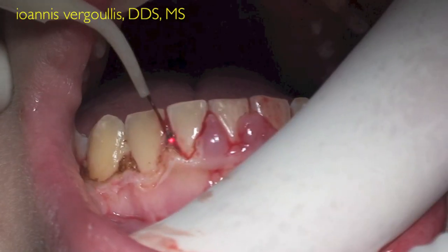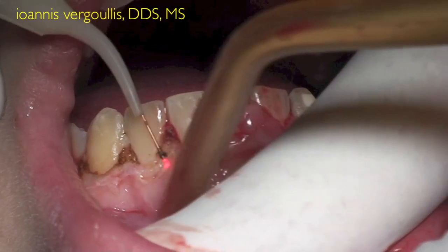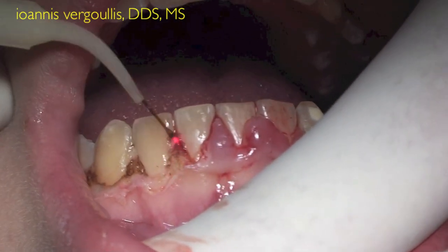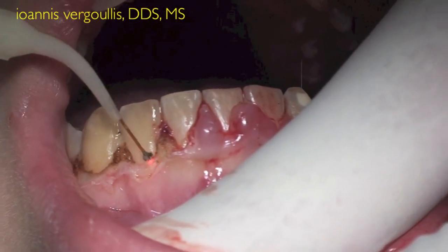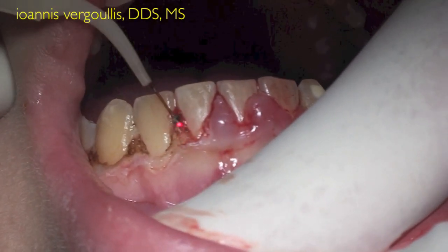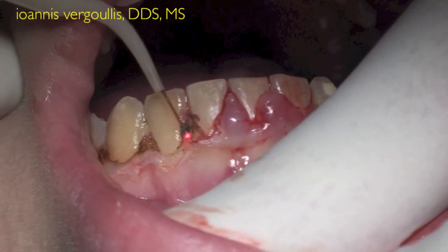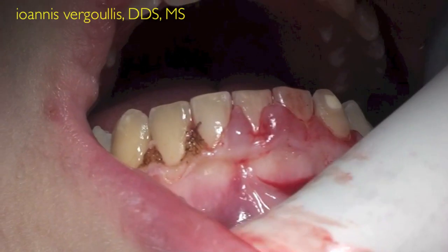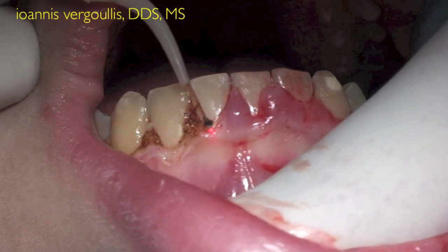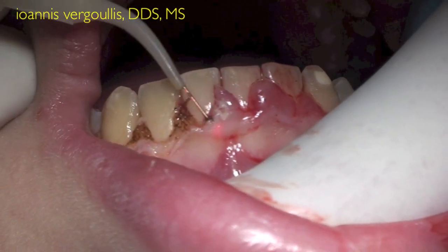As you can see, we try to avoid lasing the tooth surface. We try to stay parallel to the long axis of the tooth, and we are very thorough in removing the epithelium from the papilla and festooning the papilla. As we know, the papilla height is dependent on the interproximal bone height, so as long as the bone is there, the papilla will grow to the proper dimensions.